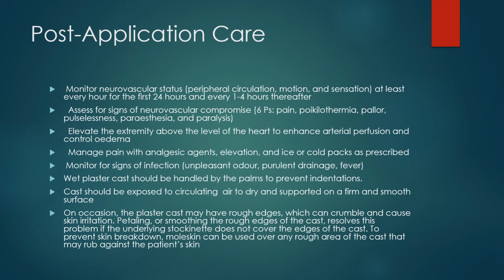So look at the post. After application of this device, what should you look out for? You monitor for neurovascular status, which is peripheral circulation, capillary refill, motion and sensation, movements of the area, and then sensation to stimulus as well. This should be monitored at least every hour for the first 24 hours and every 1 to 4 hours thereafter.